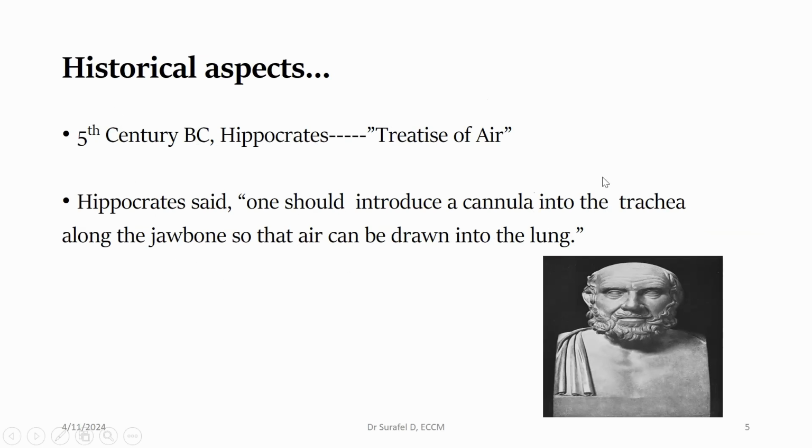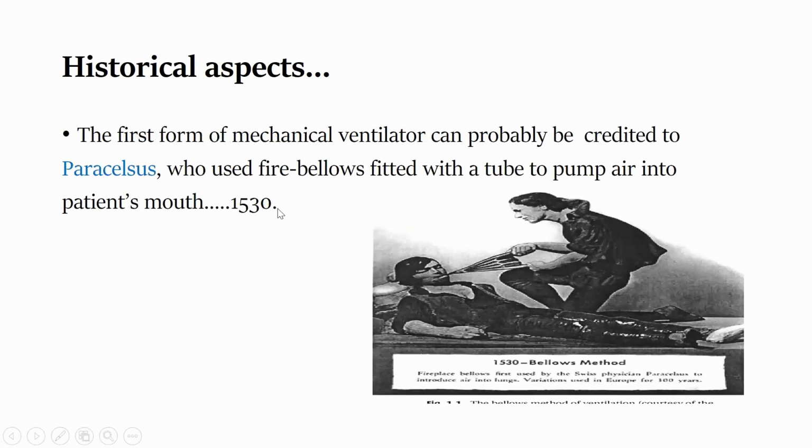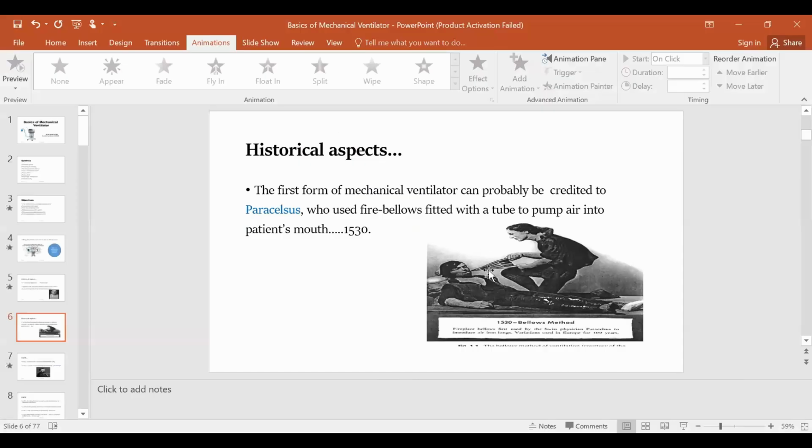So you can see how the history of the mechanical ventilator dates back. And then next there was the idea of Paracelsus. I think every one of you knows about this thing. I think they usually use this for a fire bellows, okay?